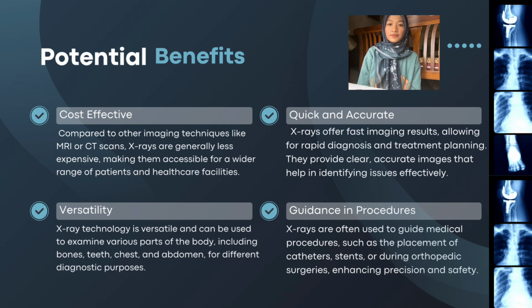X-ray machines serve as invaluable tools in providing guidance during medical procedures, whether it's guiding the placement of medical devices such as catheters or pacemakers, or assisting in surgical interventions. X-ray imaging offers real-time visualization and precise localization of anatomical structures. This guidance enhances the accuracy and safety of procedures, reducing the risk of complications and improving patient outcomes.